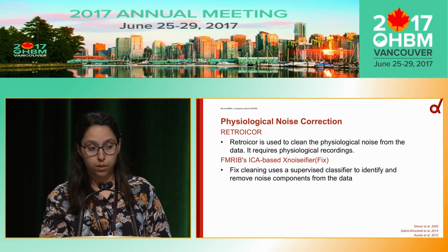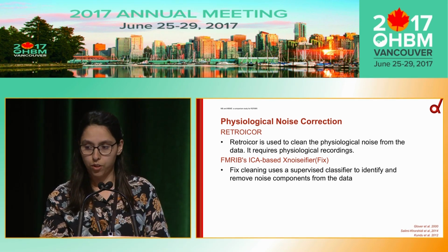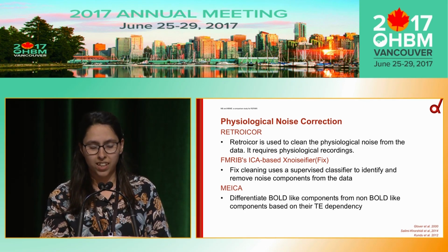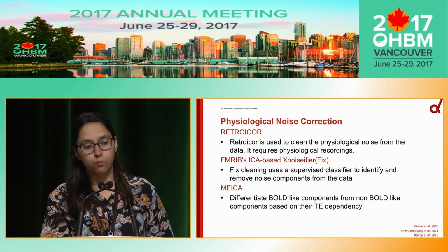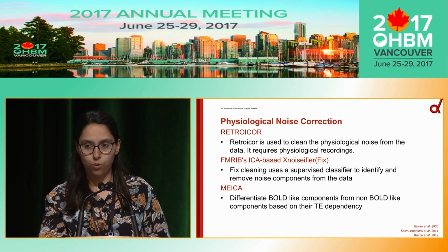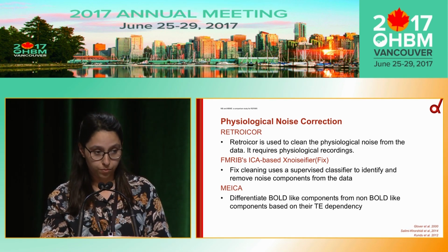It's a compulsory part of the pre-processing pipeline in HCP, but you need to train your own classifier to remove the noise from your data. The last one is multi-echo ICA. It has been debated that it is the most favorable approach to clean multiband multi-echo data, as it differentiates between BOLD and non-BOLD, depending on the TE dependency.